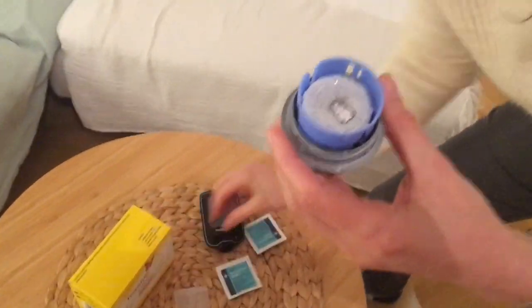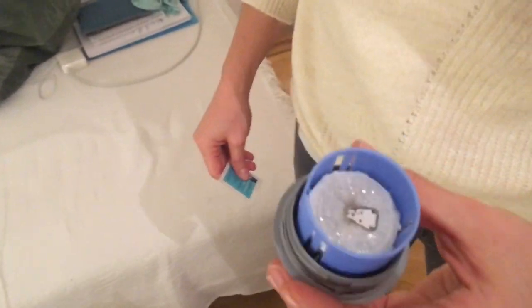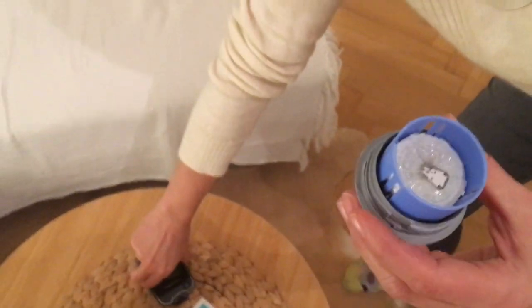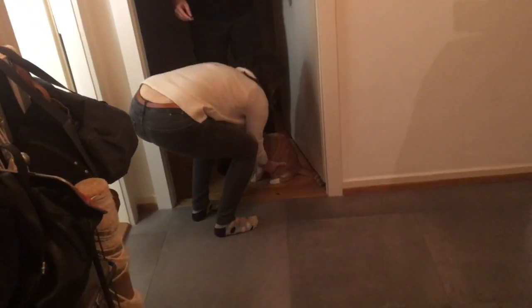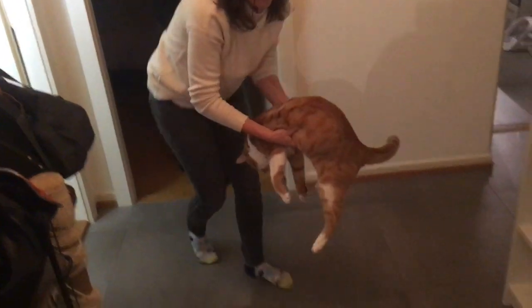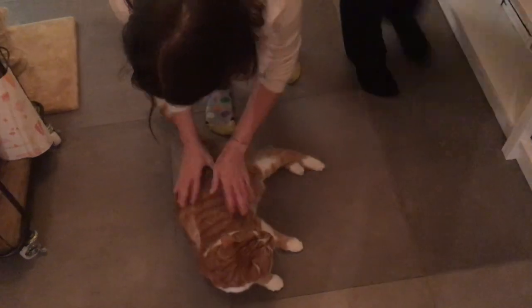There was a little moment of panic here, but we dealt with it offline. We're ready — there's glue on the sensor. We've shaved the spot between the cat's shoulder blades where we're going to apply the sensor. You can shave it with a fancy pet trimmer, or you can use a bikini one that you can buy for a few dollars.